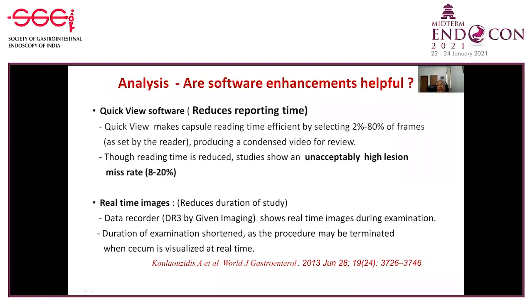As you know, it takes quite a time to review the almost 60,000 images that are recorded. It takes anywhere between 45 minutes to 1.5 to 2 hours, depending upon the expertise of the reviewer. So it would be good if we could get some software to reduce the reporting time.